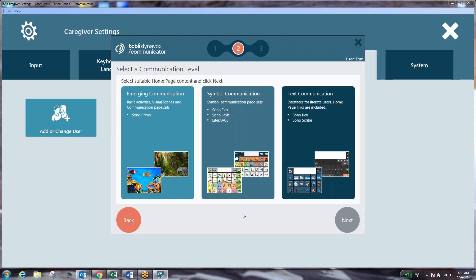Here Communicator 5 tries to break us down into one of three categories. Emerging communication which is basic activity visual scenes and communication pages. This is really a cause and effect, starting to get used to using the system and beginning access for communication. Our next is symbol communication where we use products such as the Sonoflex, Sonalexis, or Literacy. And this revolves a lot more around specifically symbols, core words, and fringe words.